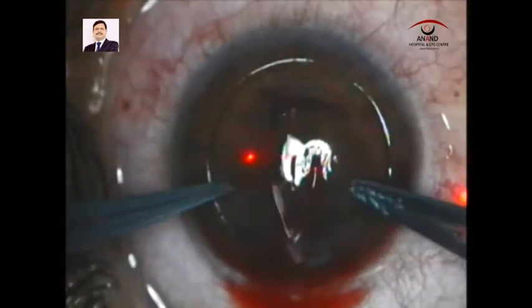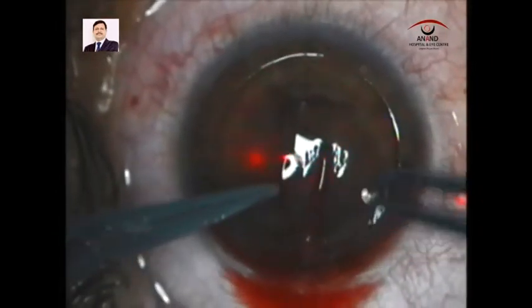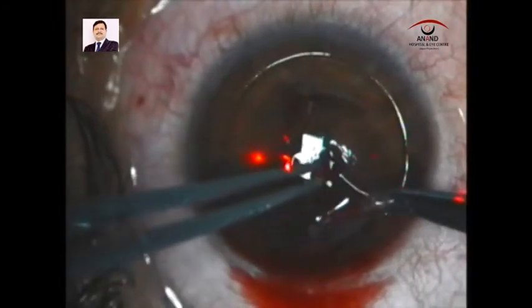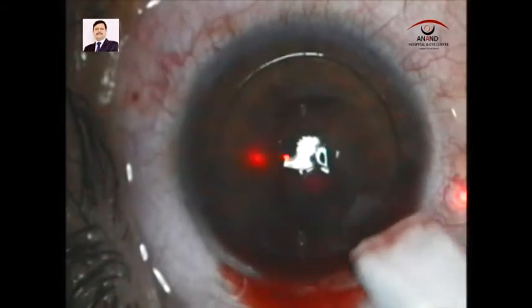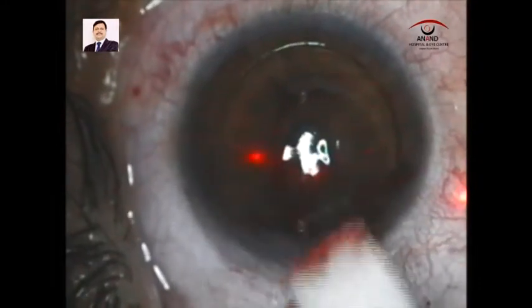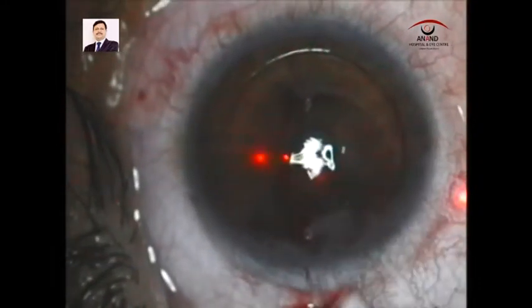We were lucky to achieve the right apposition, as you can see here — we can make out the epithelial surface up and maintain the position of the flap. We then decide to clear off the blood.